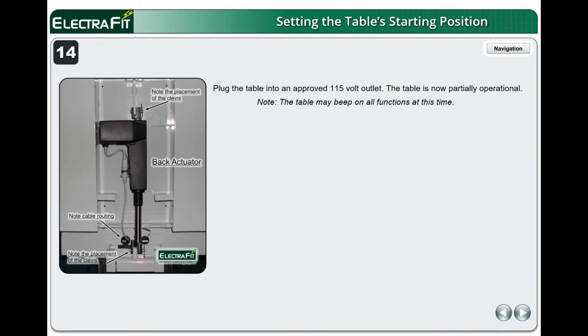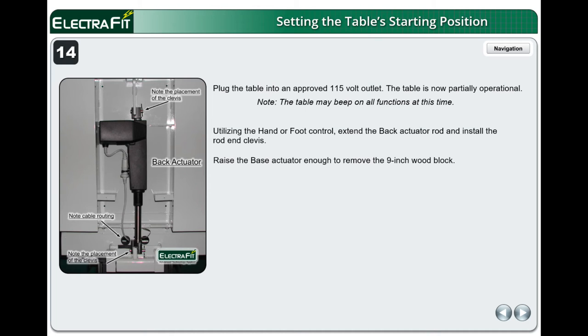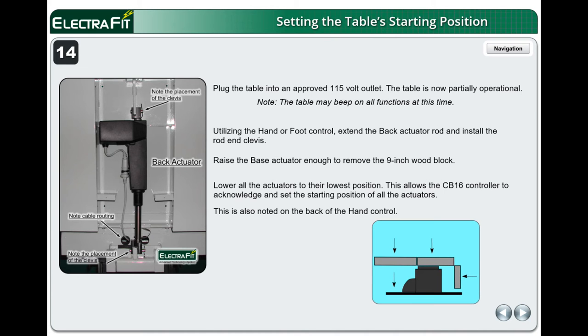Plug the table into an approved 115-volt outlet. The table is now partially operational. Note: the table may beep on all functions at this time. Utilizing the hand or foot control, extend the back actuator rod and install the rod end clevis. Raise the base actuator enough to remove the 9-inch wood block. Lower all the actuators to their lowest position.